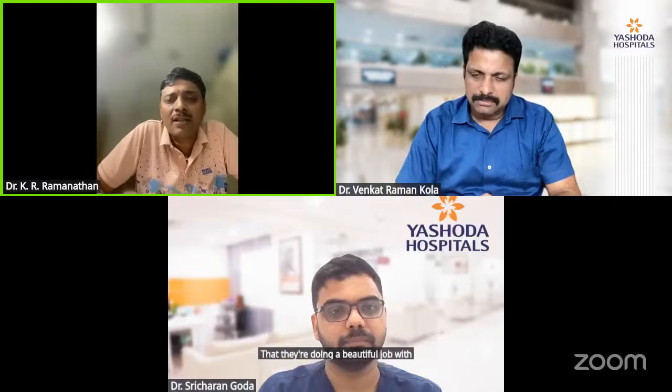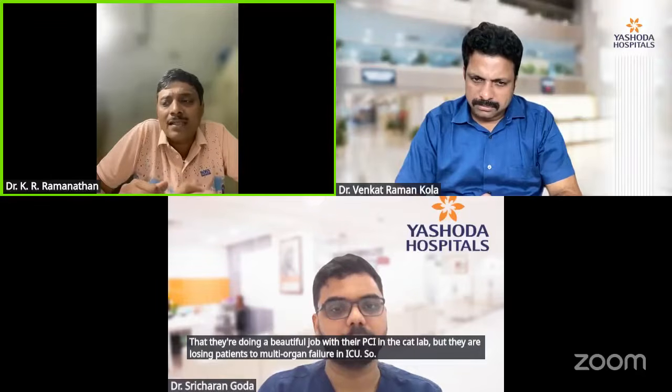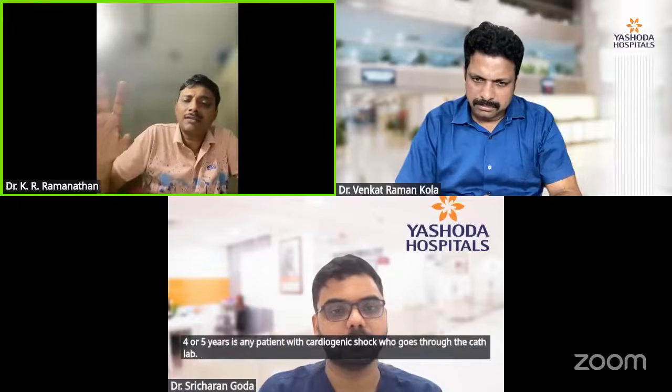The second aspect to consider is the way cardiogenic shock is managed nowadays, especially in the context of AMI. It's not just door-to-balloon dilatation time that's important now. There is an onus on balloon-to-unloading time as well, because cardiologists are realizing that they're doing a beautiful job with their PCI in the cath lab, but they're losing patients to multi-organ failure in the ICU. So one thing that has come up in the last 4 or 5 years is that any patient with cardiogenic shock who goes to the cath lab gets a right heart cath done straight away.